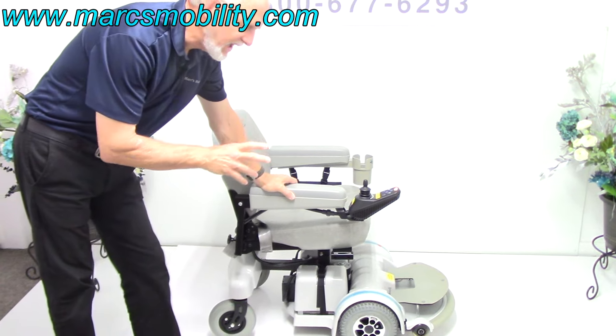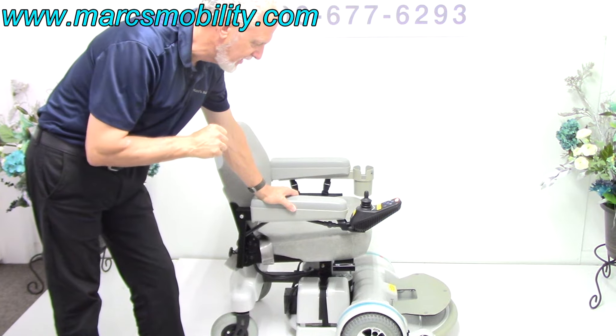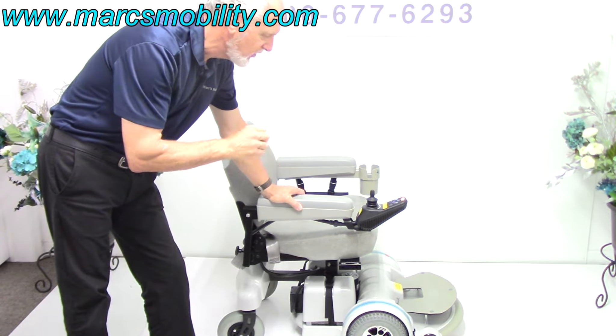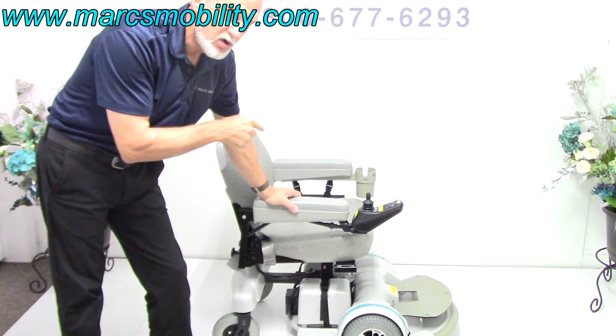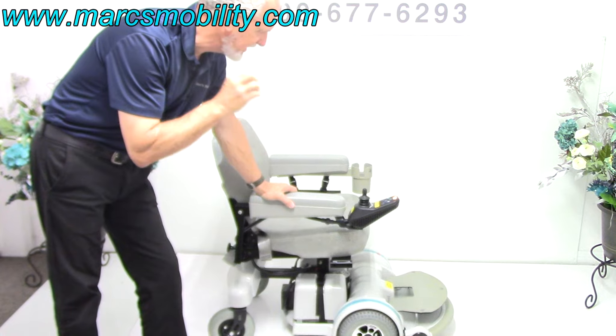This is a Hover-Round MPV-5 with the 5-inch seat lift. Very, very hard to find an MPV-5 with the seat lift in new condition like this one. This chair has less than 5 miles on it — it's practically brand new.